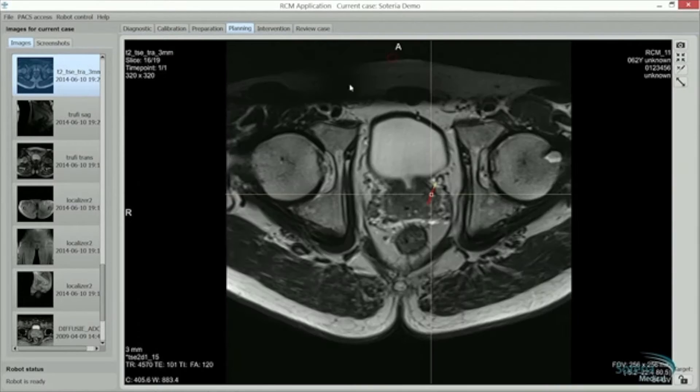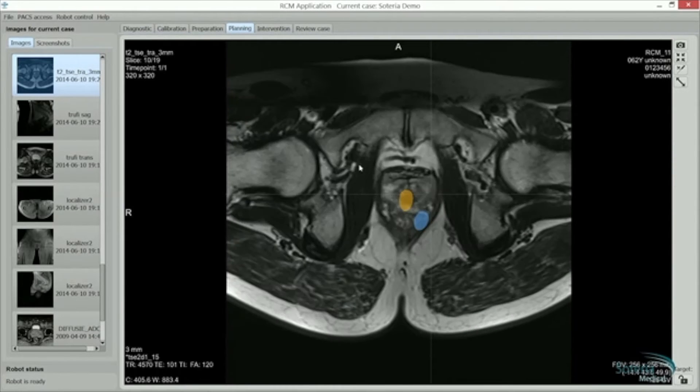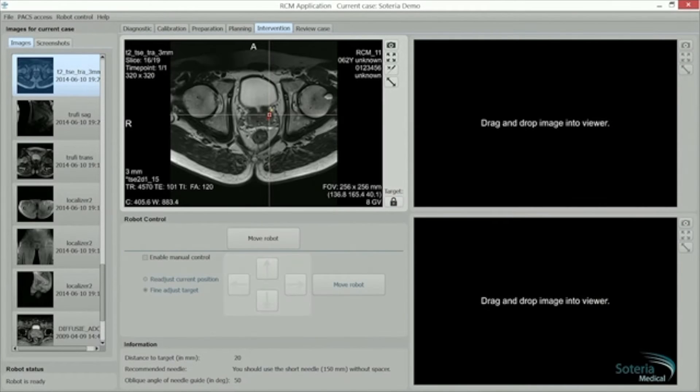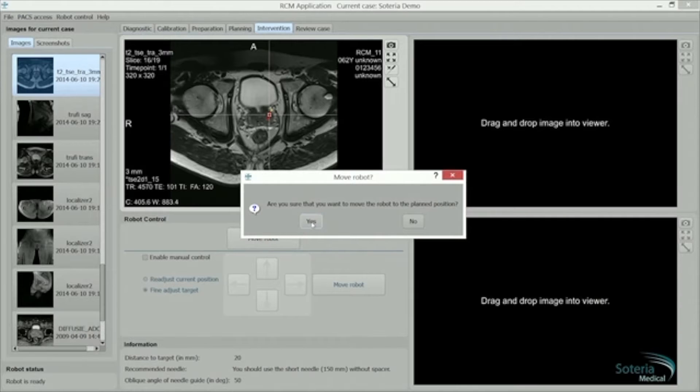The screen is clicked and the target confirmed. Orange is where the computer thinks the probe is, blue is where you want it to be, and that has to be aligned. The target is locked and the intervention tab appears. Move robot is clicked and when prompted 'are you sure,' click yes.